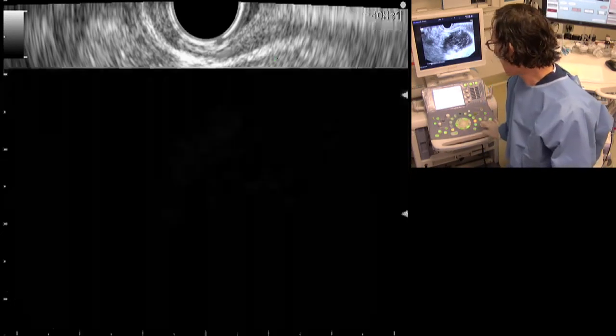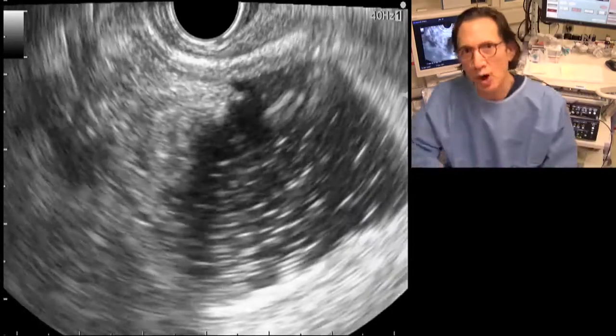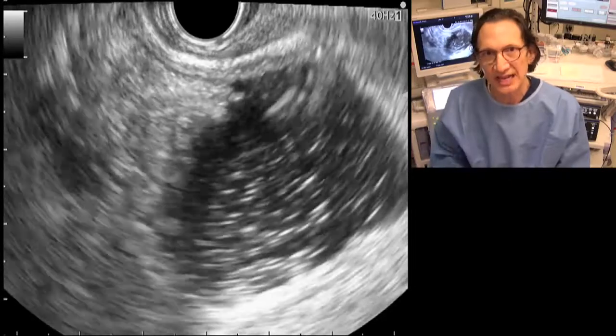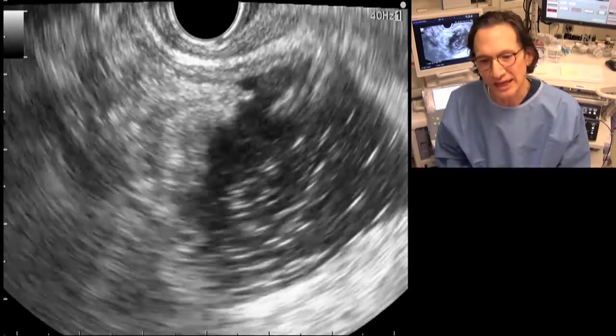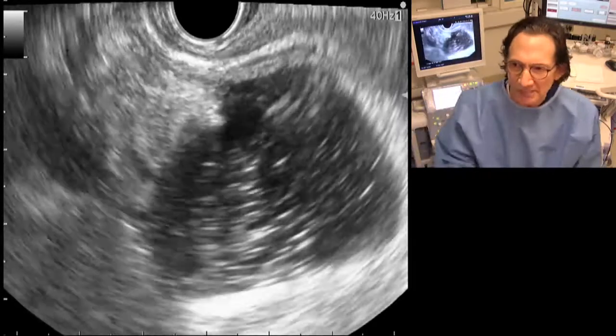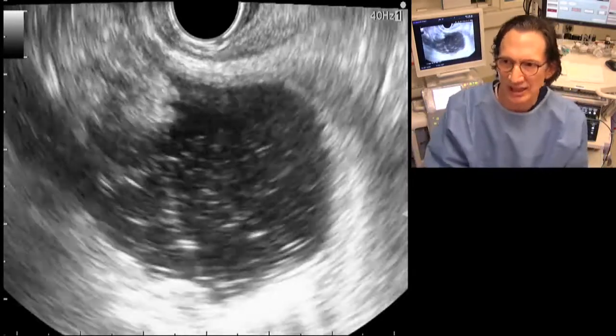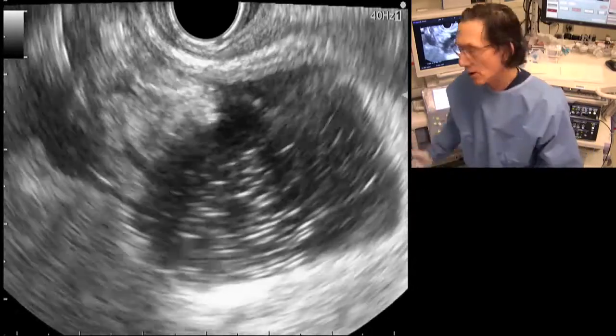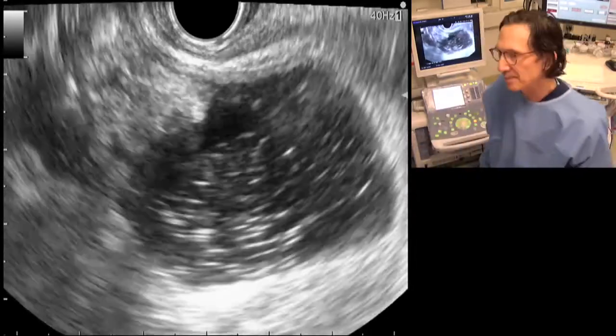Now, in the interest of time, I'm not going to go through all the anatomy. We're in a good position now, and I'd rather just get this case done so that we can show you other things, and maybe there's time I can talk a little more about gallbladder drainage. We're in a great position, so I'm not going to change anything. I'm going to hold my position right here, and I'm going to ask our nurses to open up our stent.